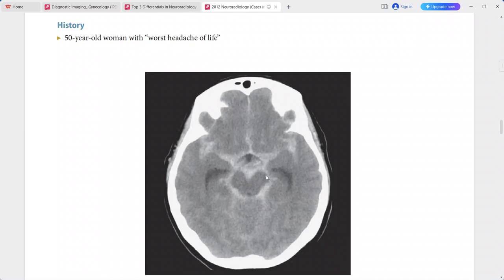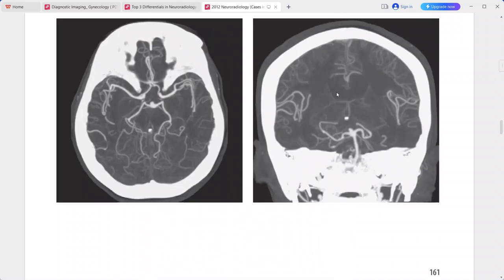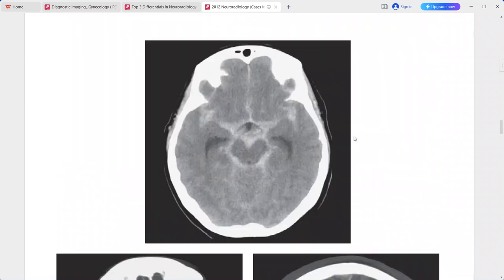There is also dilatation of the temporal horns due to hydrocephalus. MIP images show a superiorly directed outpouching arising from the basilar artery terminus, consistent with a basilar tip aneurysm. This is non-traumatic subarachnoid hemorrhage secondary to a ruptured basilar tip aneurysm. Differentials include non-aneurysmal perimesencephalic subarachnoid hemorrhage and traumatic subarachnoid hemorrhage.